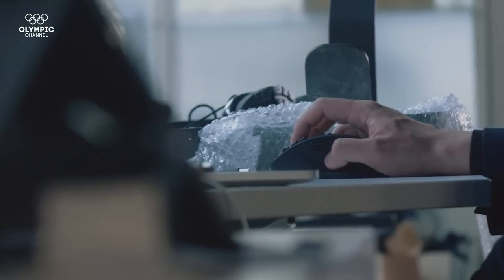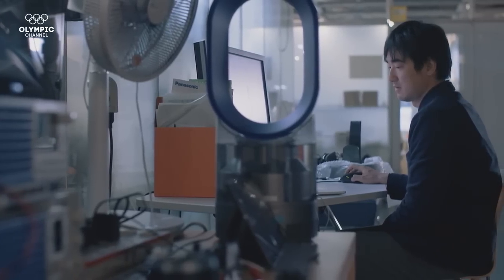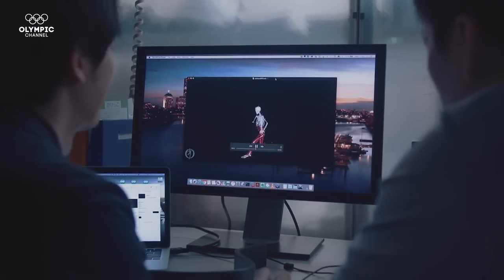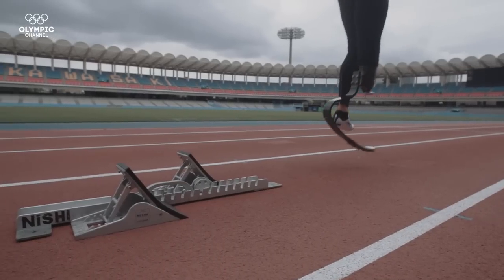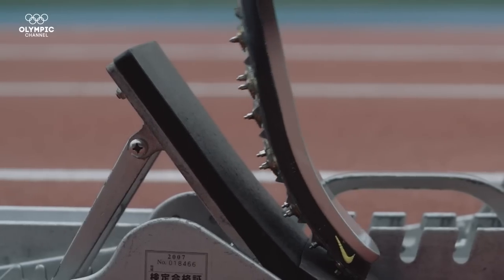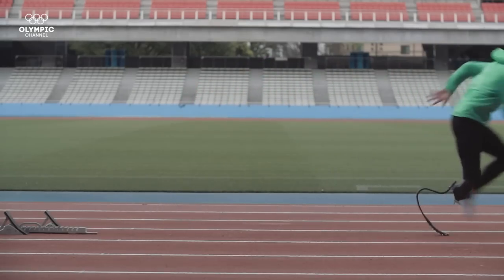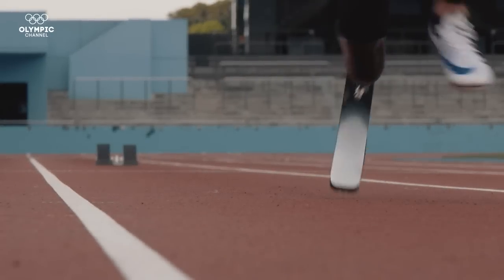For sprinting, we use the leg as a sprint. We can pump up our body and we have an aerial time, which is the time we don't have any contact with the ground. The prosthesis pushes our body upward and hops. A Paralympic athlete can run at the same speed as able-bodied sprinters using 25% less oxygen due to the prosthesis energy return. The carbon fiber blades produce three times more energy return than a human ankle.